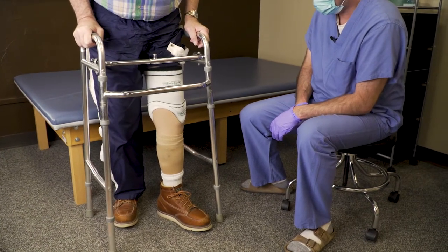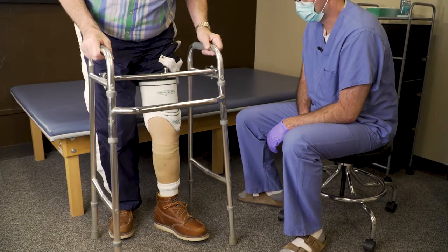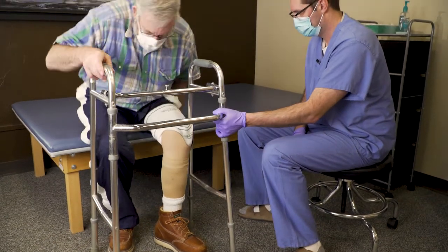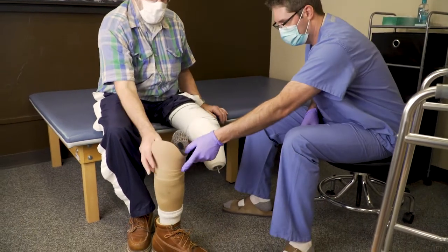Yep, all set. So how do you remove the prosthetic then? Sit down. And there's a button on the side. Press that. There she goes.